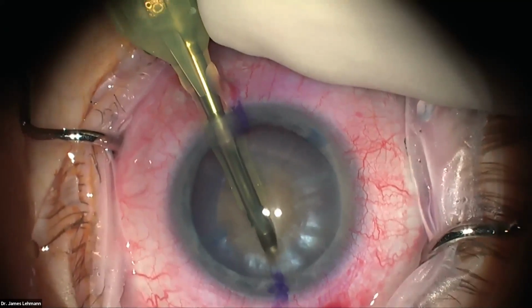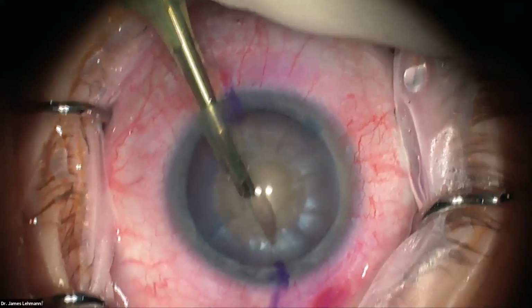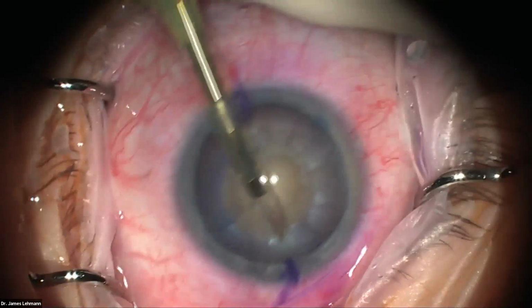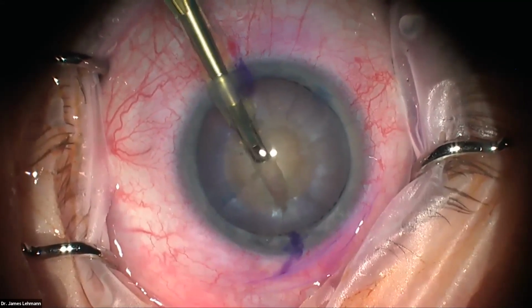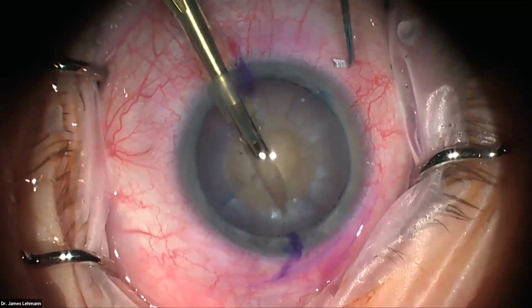And then how far down do I want to go? Look, I'm starting to see a red reflex there. I'm going to focus down for you. Some striations. I think I'm pretty good there to be able to crack. So we're going to give that a chance. If not, I'll go a little bit deeper.